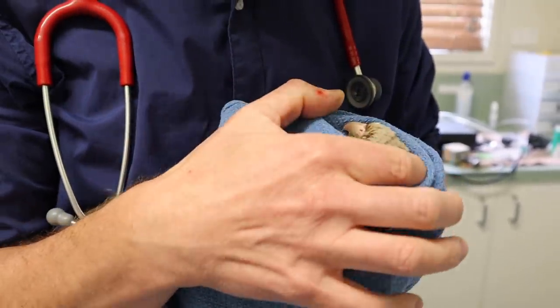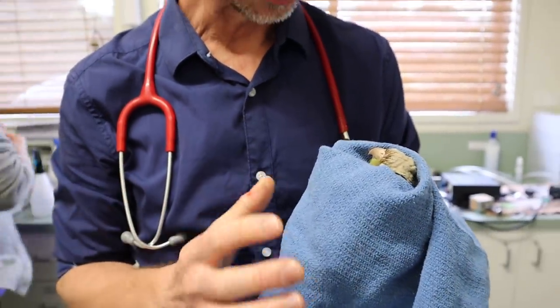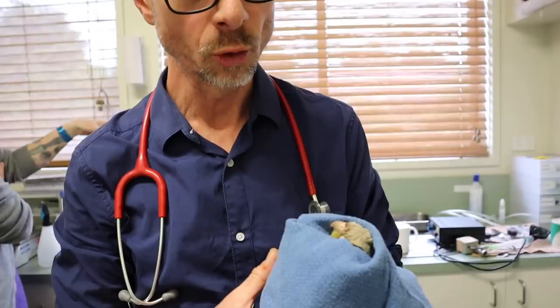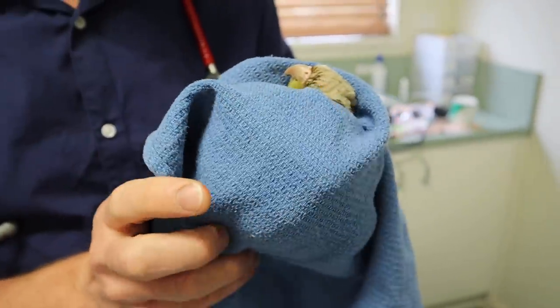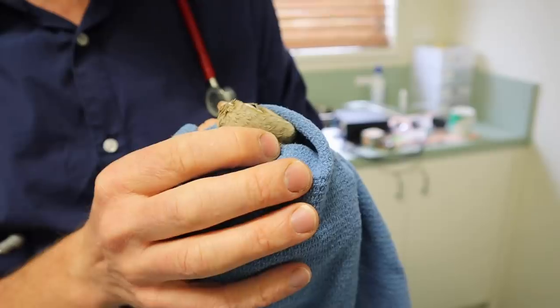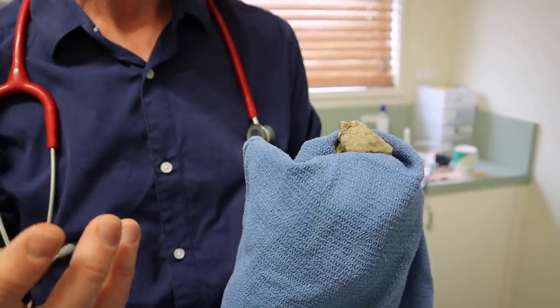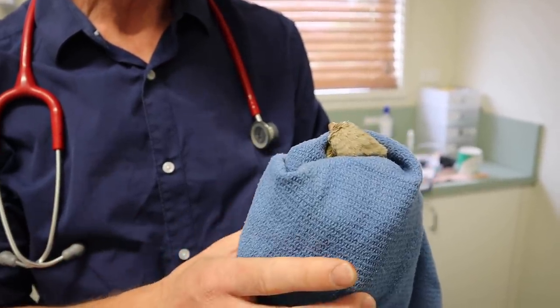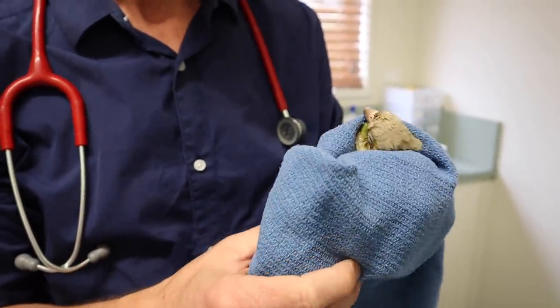He'll wake up very quickly from that anaesthetic because it's just a gas. We'll just hold this on so he doesn't bruise. I like to nurse tame birds awake. If they're used to human contact, in my hands they keep warm and they're a little bit less stressed. If it's more a wild bird, I'll pop them in a hot box in a darker environment so they can wake up gradually by themselves. They often have an excitable phase, especially if they're just gassed down without a pre-sedative, and they can get a little bit disorientated. So just gently holding these tame birds can help them wake up a little bit better.